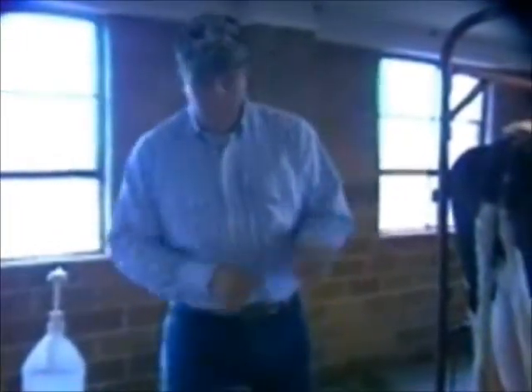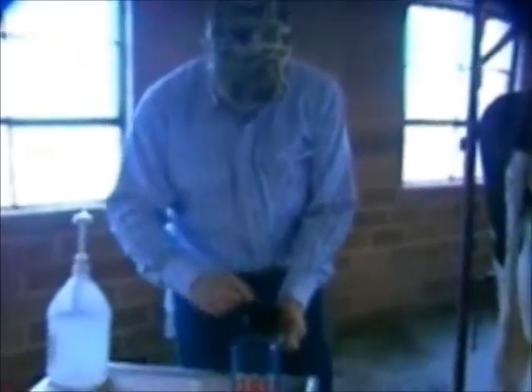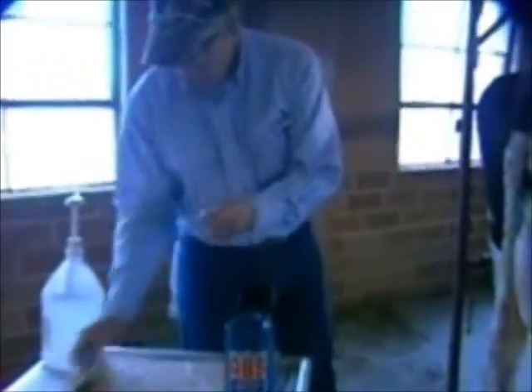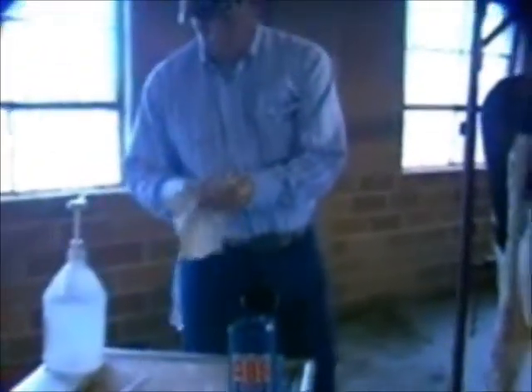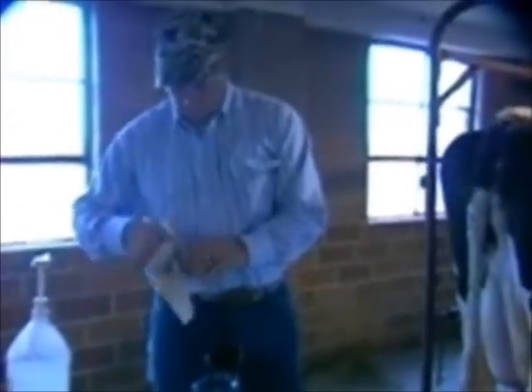The straw, which is a half cc straw, is allowed to thaw a minimum of 45 seconds and usually can be left with reasonable fertility 10 to 15 minutes within the thaw bath. After thawing, the straw is dried off because water is toxic to the semen, and so the straw must be carefully dried to prevent any kind of water contact with the semen.